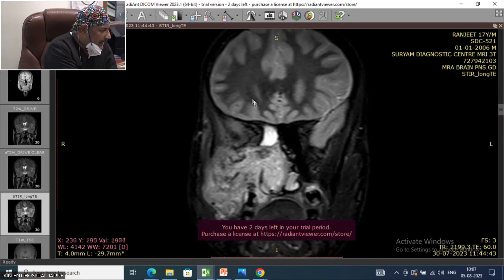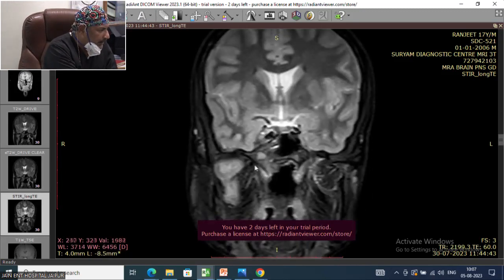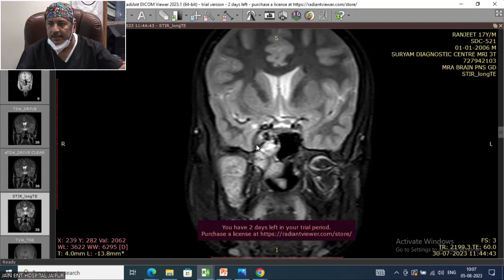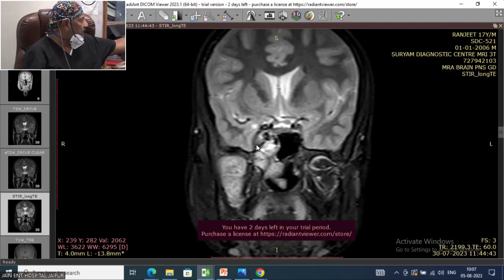If it is extending high up into the temporal lobe, it goes from the pterygoid roof into the temporal fossa. Similarly, it pushes the dura, you can bring it out easily. This cavernous component through the superior orbital fissure, you can bring out easily without any fear. So all these extensions, after the denker's and medial part removal, need just pulling out the tumor with adequate exposure. That's it. You don't need to frighten.